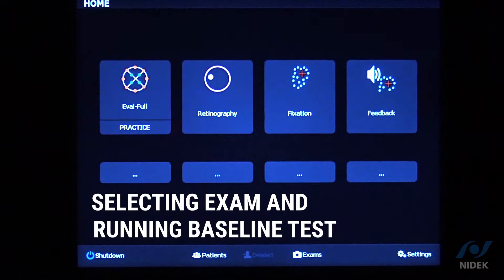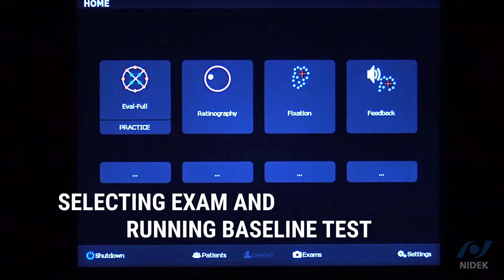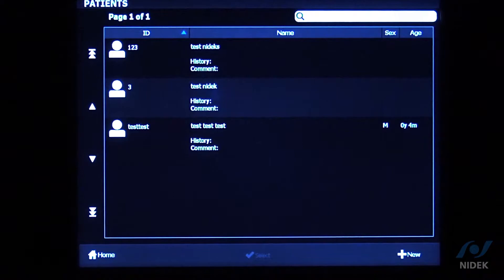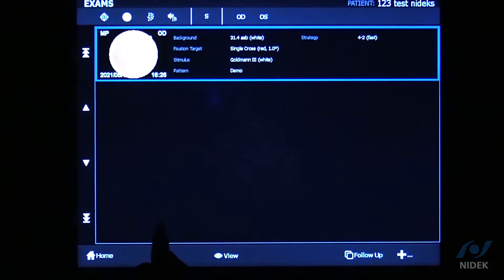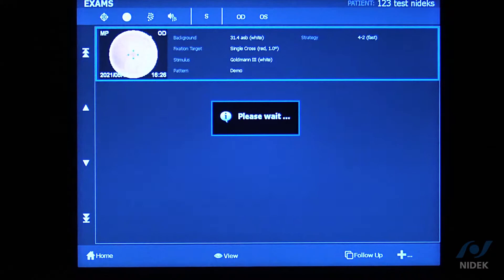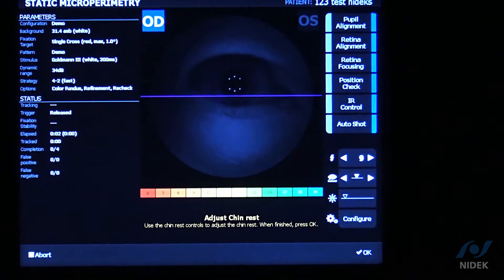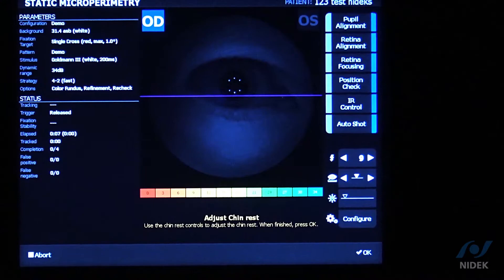With the Nidec MP3 microperimeter, we can follow up on a baseline exam accurately because we have a 30 Hz eye tracker. To do a follow-up, select the patient, go into their Exams, select the exam you want to follow up on, and click the Follow Up tab on the bottom right. The MP3 will automatically align, jump to the back of the eye, and focus. It knows which eye we're doing because we selected it in the baseline exam.